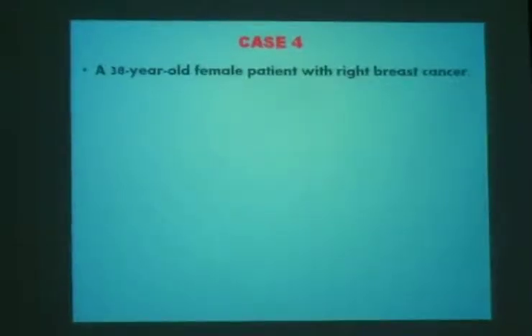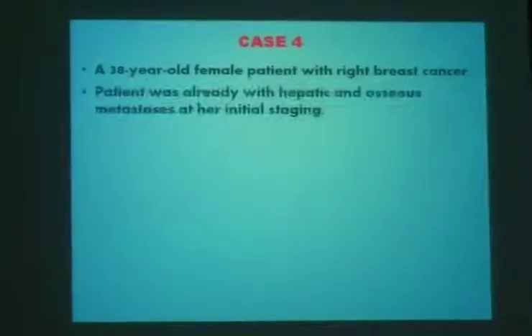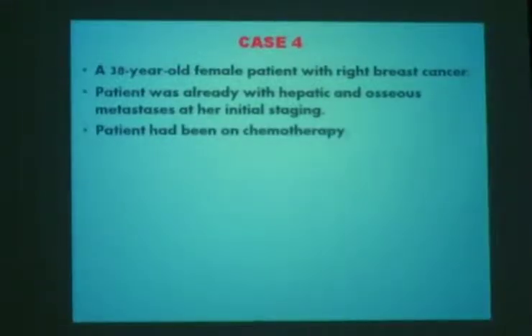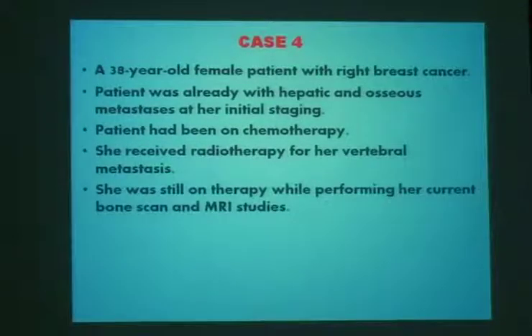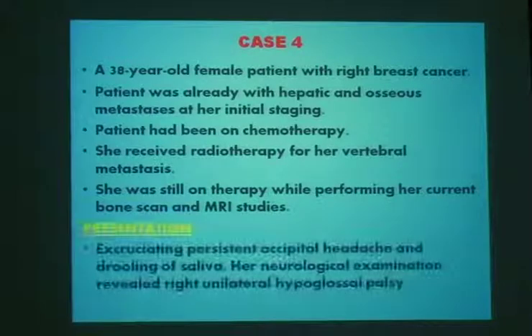A 38-year-old female patient with right breast cancer. The patient already had hepatic and osseous metastasis at her initial staging. She had been on chemotherapy and received radiotherapy for vertebral metastasis. She was still on therapy while performing her current bone scan and MR studies.